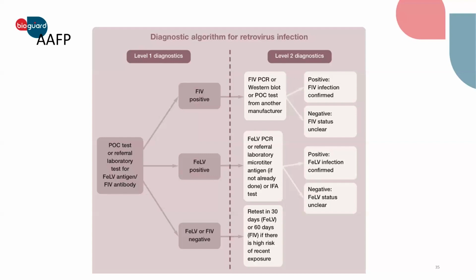So that's the AAFP suggestion for diagnostics for FeLV and FIV. They suggest the level 1 diagnostic, that's usually done in the clinic.